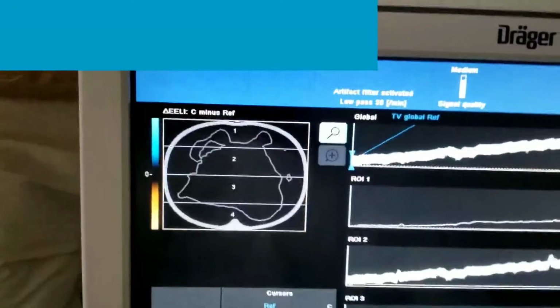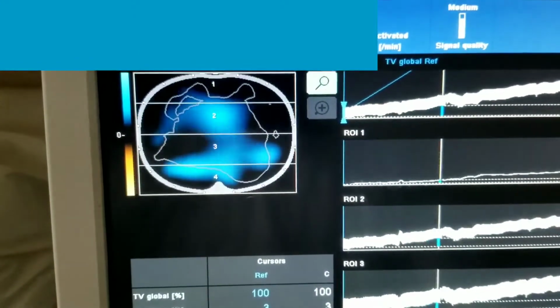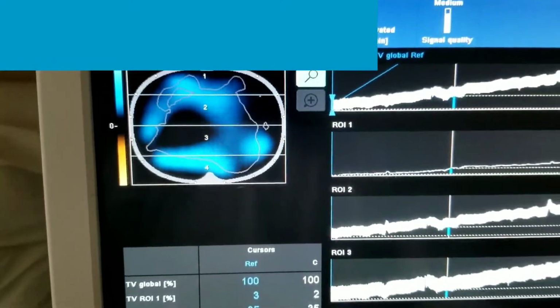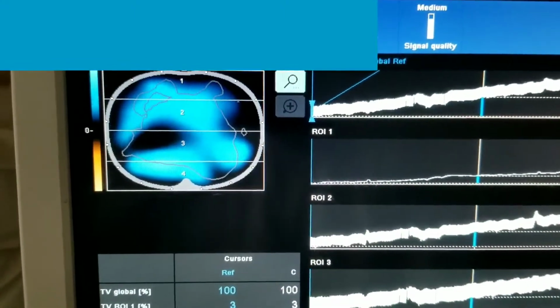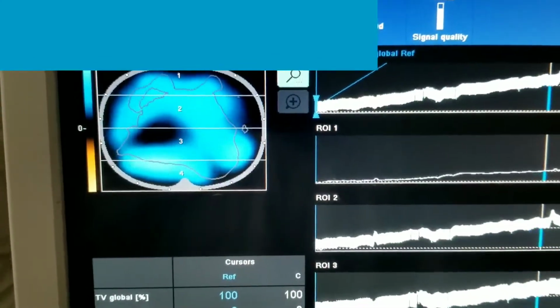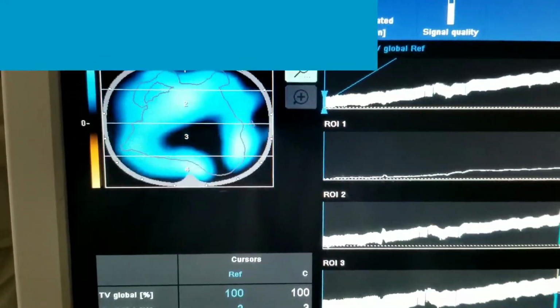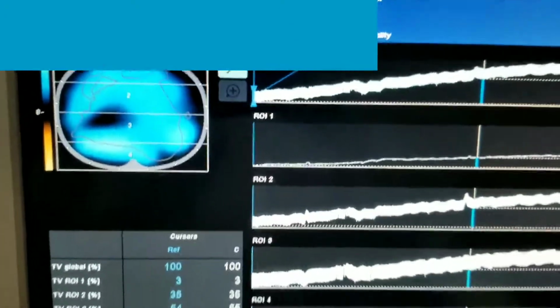Let's do the color a little bit more rapidly now that we understand. This lady is continually recruiting. Holy smokes. Wow. Okay, sorry, I'm really impressed.